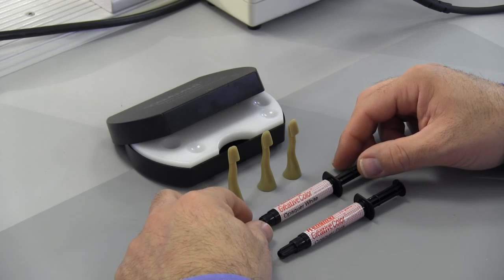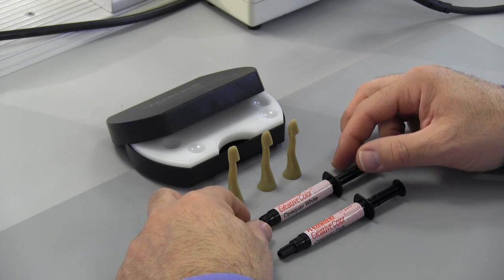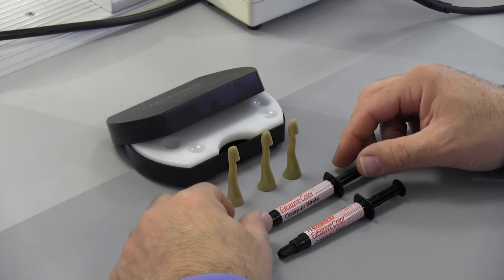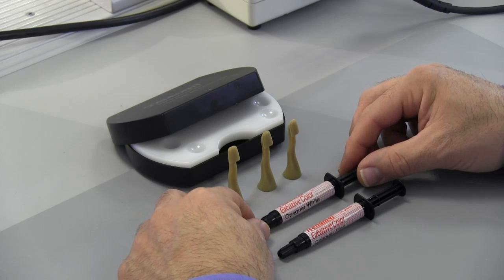Today in this exercise, we're going to show you the value of pink opaque over white opaque, not just by talking about it, but visually showing you how each one works and what it does for you in your office.